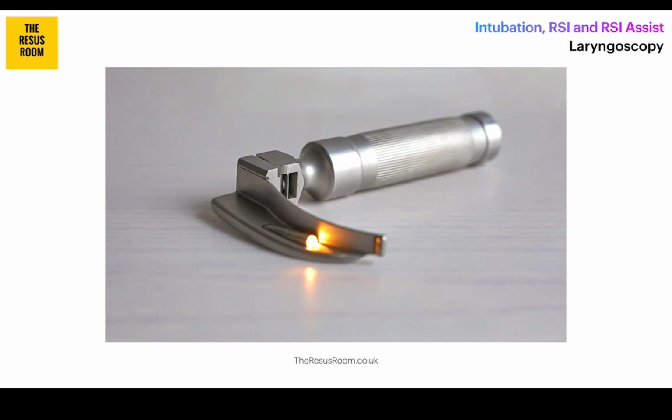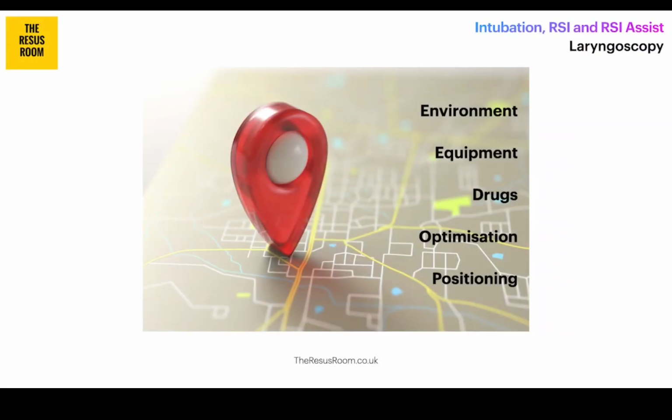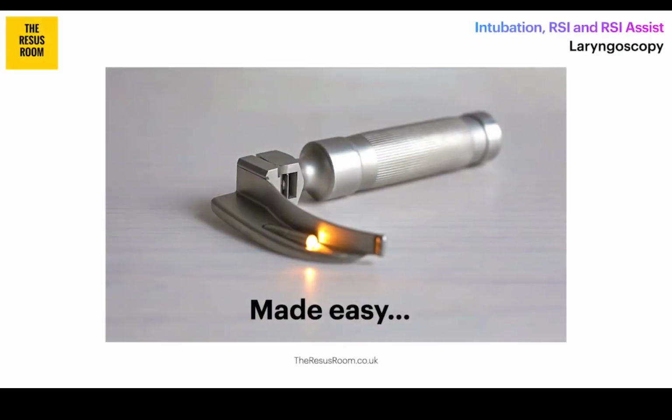Now, I can forgive you all for thinking that this is by far the most important of all of today's talks. And whilst there are loads of excellent bits in here that we're really keen to share, we can't ignore the fact that being excellent in managing the environment, choosing the best equipment, picking the best drugs for your patient, and optimizing their physiology in the context of an RSI, and being absolutely fastidious about positioning can all hugely influence laryngoscopy and make a potentially difficult task relatively easy. But the focus of the next few minutes is to try and make laryngoscopy itself even easier, despite all of those cheats that have preceded it.